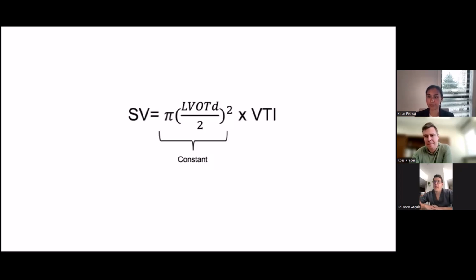Yeah. I've seen pretty consistent measurements with minute VTI, so I like it a lot. And I do this as well in my ambulatory patients. I have a clinic where I study patients with AV fistulas who usually have a pretty high minute VTI, and this is what we use to monitor the hemodynamic consequences of having an AV fistula for hemodialysis. So this is not an exclusive thing for shock. I think it's a very universal way to assess cardiac index. Yeah, totally agree with all those points.